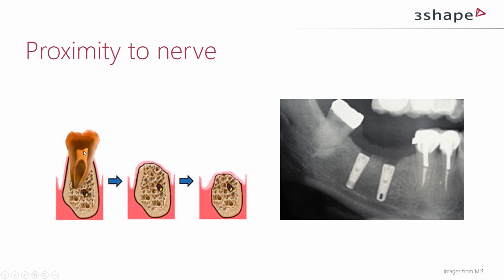So the tooth is removed or lost, and then again, to reduce weight in the skull and also to remove bone that is not needed, nature will deform and absorb the bone that is on top, putting the rooftop of the mandible closer and closer to the nerve. So we can see it doesn't change from below, it actually resorbs from the top down.